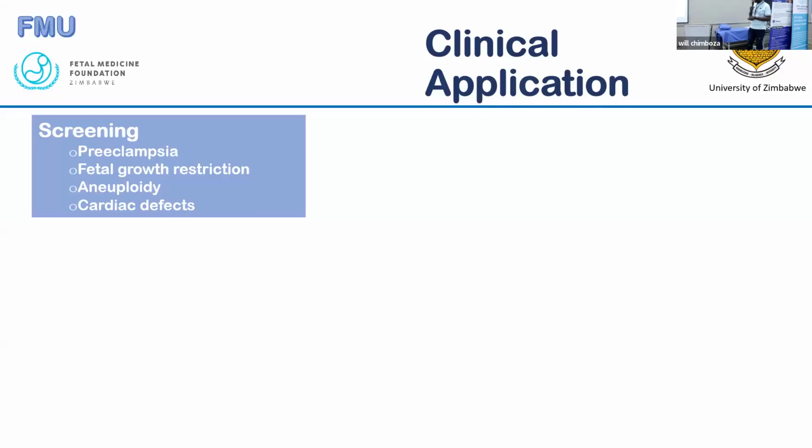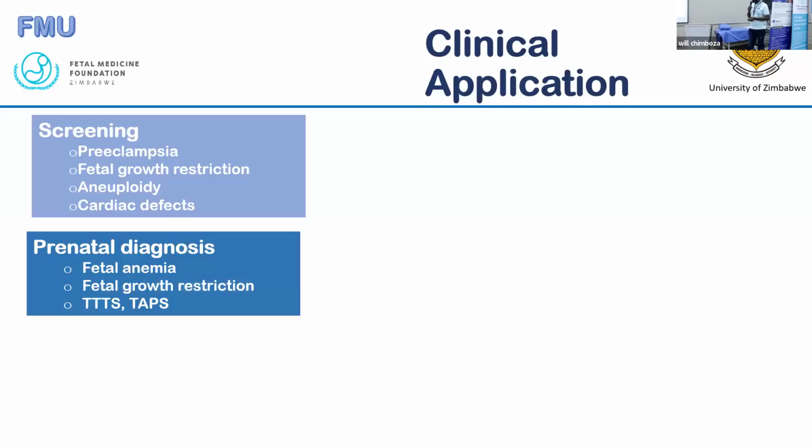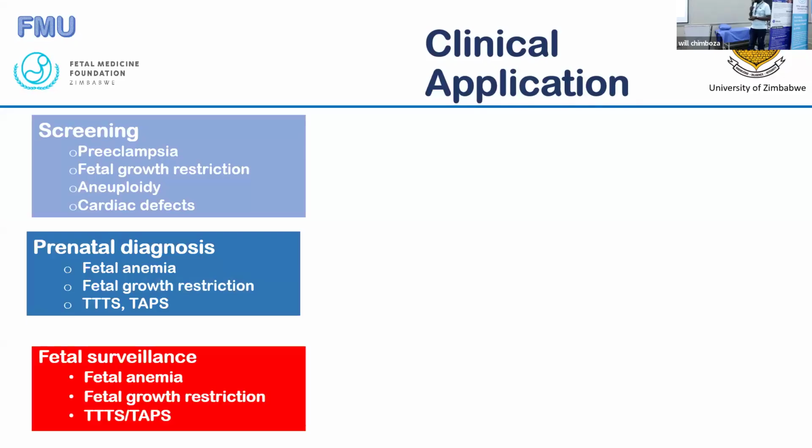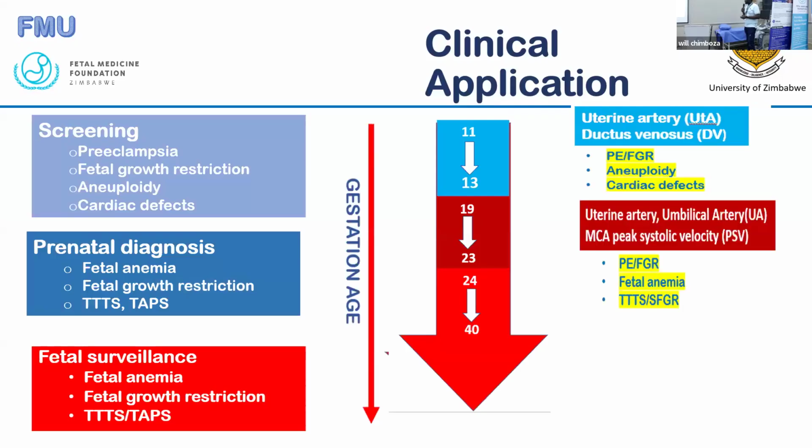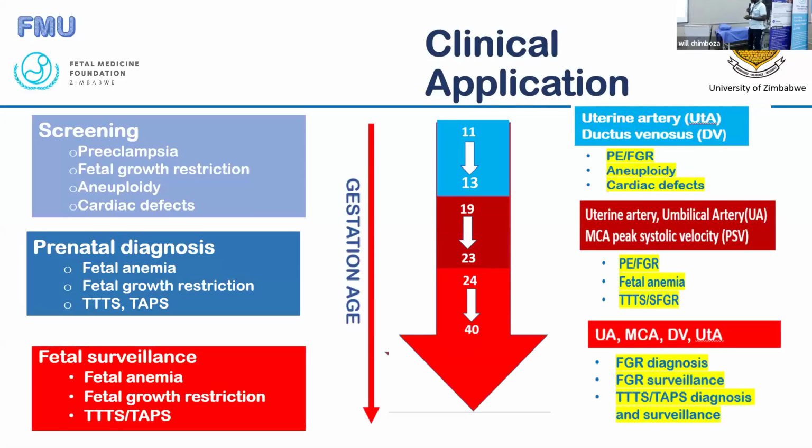So I'll just summarize the clinical applications of Dopplers outside fetal growth restriction, which will be talked about by the presenter who will talk after me. In the first trimester, Dopplers play an important role in screening for preeclampsia. There is a presentation in line which will delve into this in greater detail.